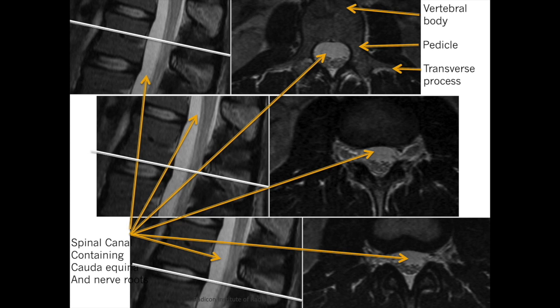On the bottom pair of images, a cross-section through the disc shows the thecal sac and facet joint, while the relevant nerve root is already outside the exit foramen.